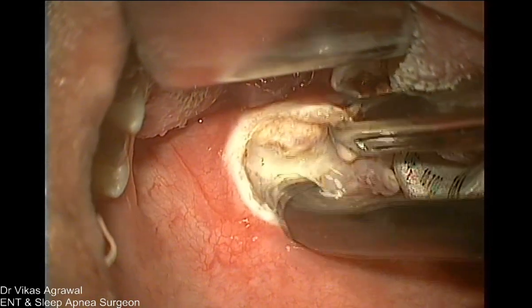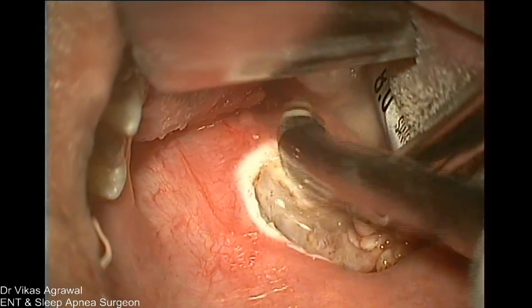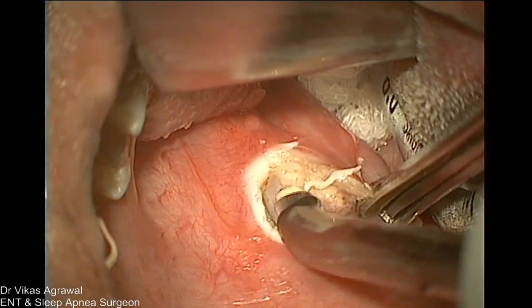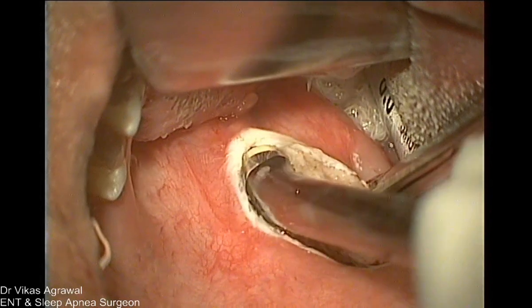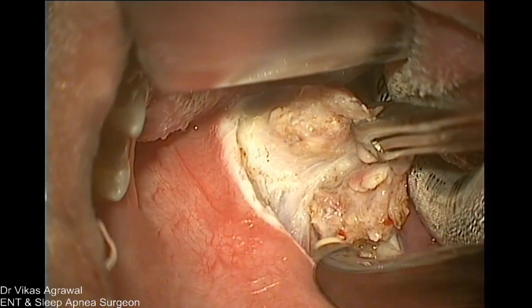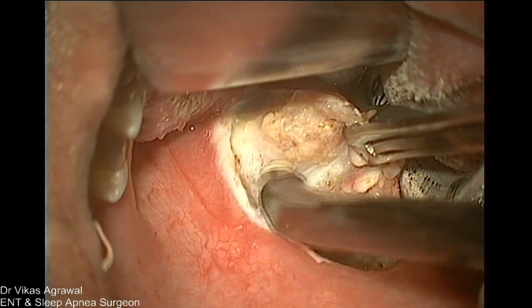Now you see that we are going lateral to the tonsil and this is the lower pole of the tonsil, correct? This is the lateral part of the tonsil which will be removed completely. But as we go into the lower pole, see, have you seen the muscles at all? The muscles of the tonsillar fossa are not seen. This is the fascia.